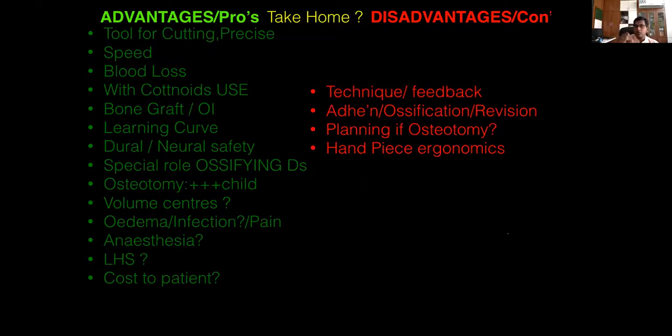Handpiece ergonomics is not as good as that of the burrs which we have evolved, because burrs are finer. One thing to mention: the burrs we use like a pen, this we use like a trumpet. So this is a different way of using it. Ergonomics actually comes in our way, but it will definitely improve with time. It can be rash if you are aggressive, and given the typical nature of an orthopedic surgeon, it can land you in problems. Be safe.